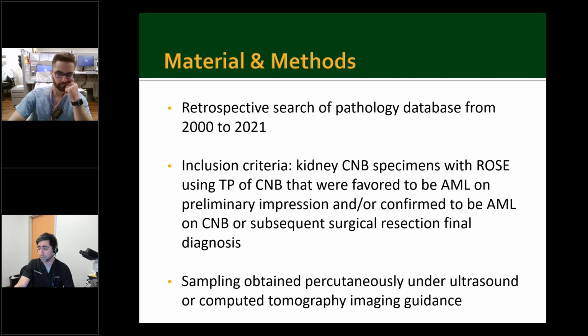To perform the core needle biopsy, the interventional radiologist employed CT scan or ultrasound image guidance, which ensures the accuracy and precise sampling of the kidney masses before giving it to us as cytopathologists to get a chance to look at the slides.